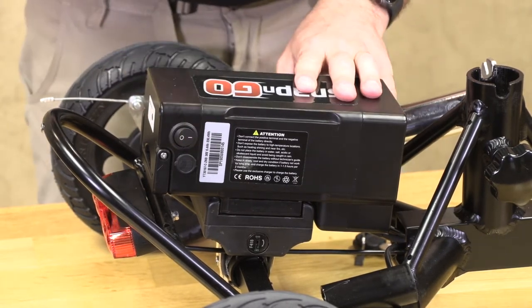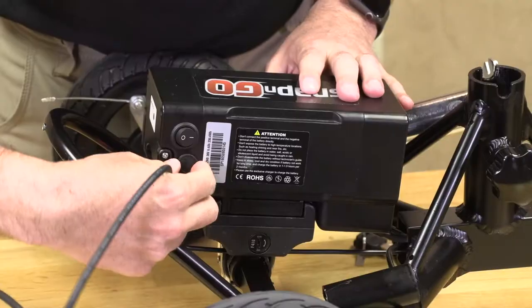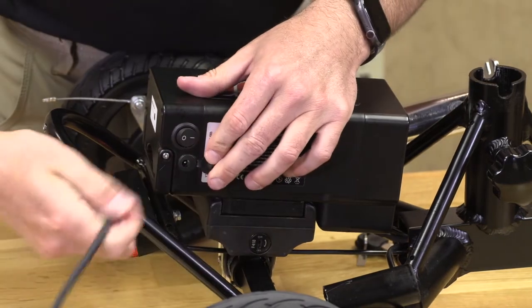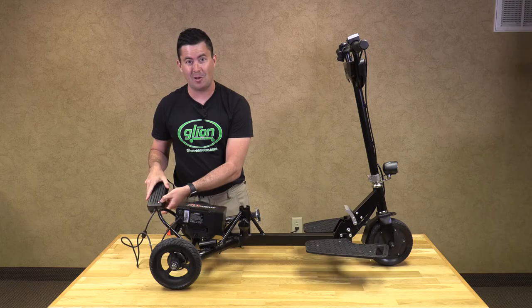If you want to, you can charge your battery on the frame or off of the frame. To charge, just raise the rubber safety cover, plug it in, and make sure you have red on the indicator and you are ready to go.